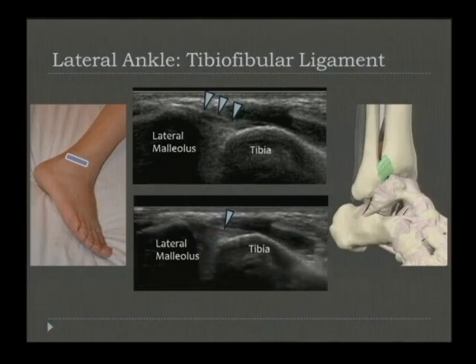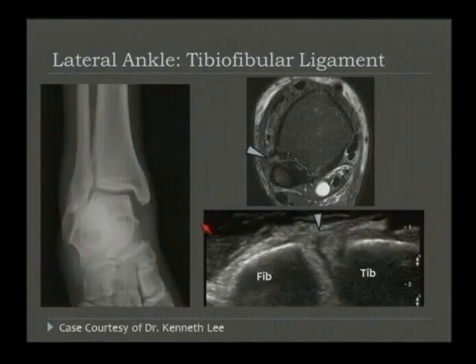This patient came in, they had a known deltoid ligament injury. They were very lax medially. Here on radiographs, this is the tibia and this is the talus. Here you can see widening of this medial clear space with a small avulsion fracture. This patient had a deltoid ligament tear with an avulsion. The clinicians were worried more so that they might have a high ankle sprain and injury to the anterior tibiofibular ligament.